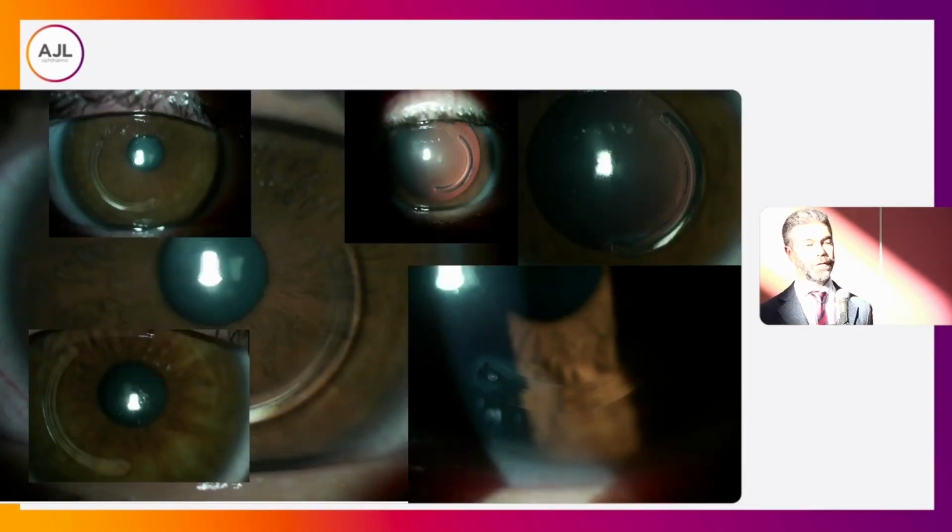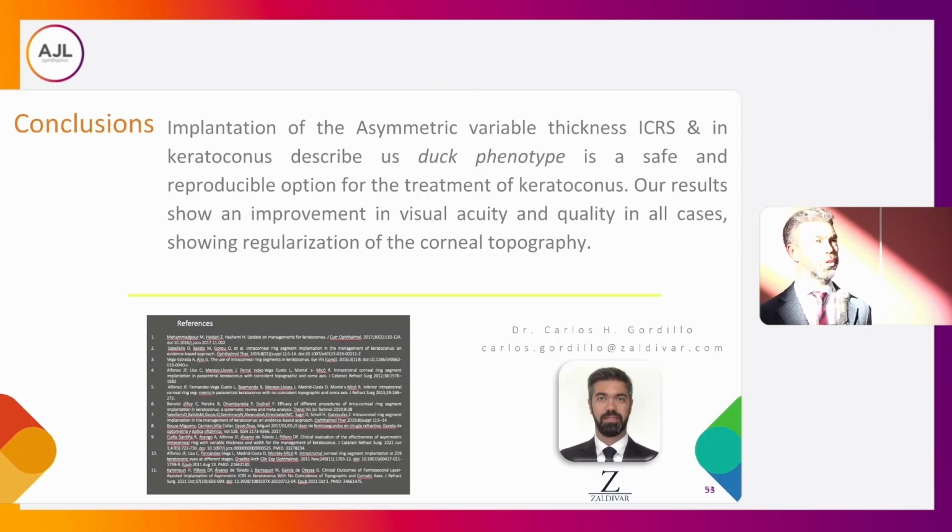So to finish, I will give you my conclusion for this kind of phenotype, duck phenotype. This is nowadays, for me, the gold standard for the treatment of keratoconus, because it not only reduces the corneal aberration, it gives the patient a better and more visual quality and visual acuity. Okay, thank you very much.